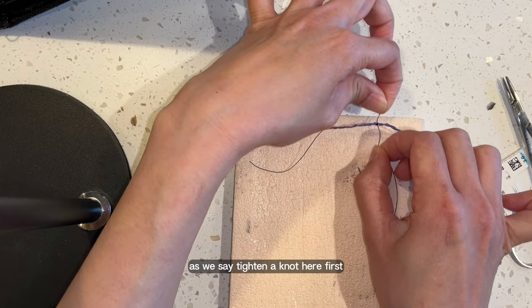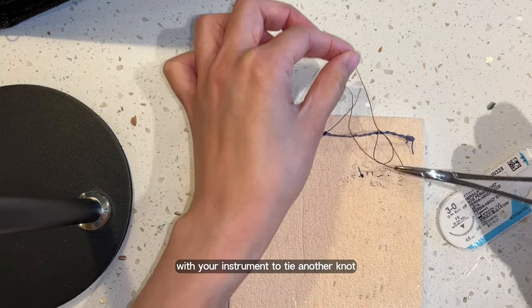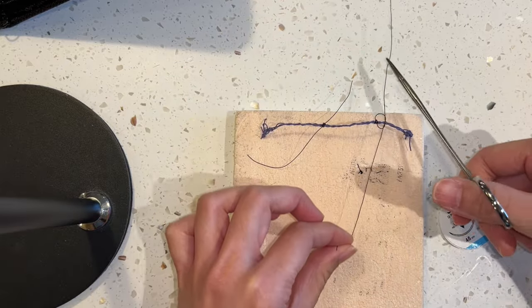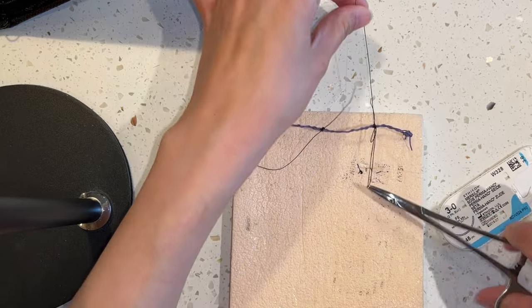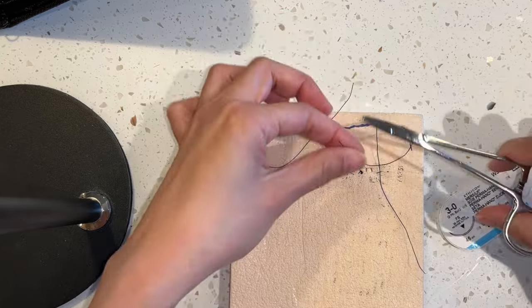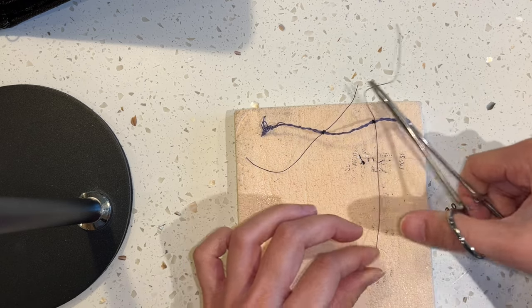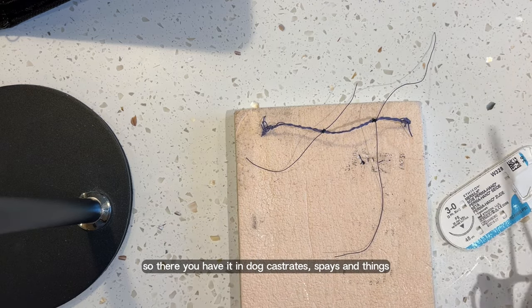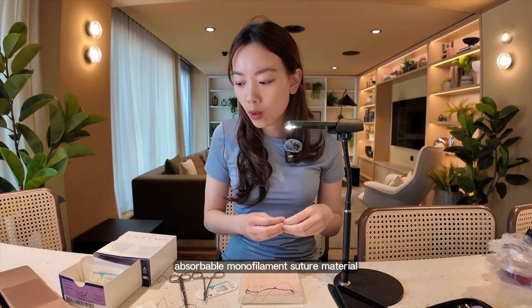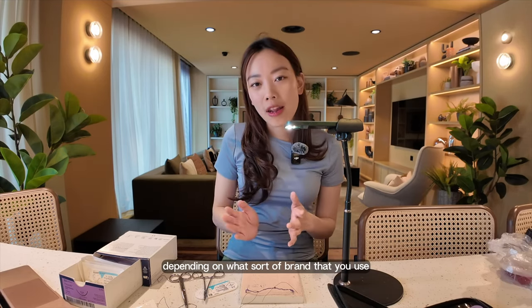Tighten the knot here first, and then keep going with your instrument to tie another knot. So there you have it. In dog castrates and spays, I tend to use an absorbable monofilament suture material, which tends to be your PDS or monoline, depending on what brand you use in your practice.